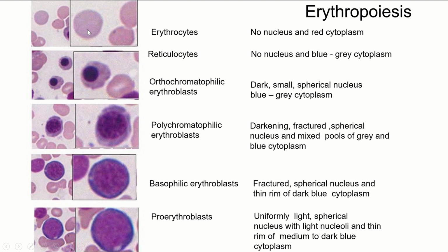The reason is the reticulocyte still is making hemoglobin, right? It still needs to make more hemoglobin to be a fully mature erythrocyte. Remember, hemoglobin is the main protein in erythrocytes. And so in order to make that hemoglobin, it still needs mitochondria and it still needs ribosomes and everything like that to make those proteins. That higher concentration of mitochondria, of ribosomes, of everything like that makes it stain more blue. And then the erythrocyte, once it's fully mature, is chock full of hemoglobin, chock full of protein, so it's going to stain much more red, much more pink.